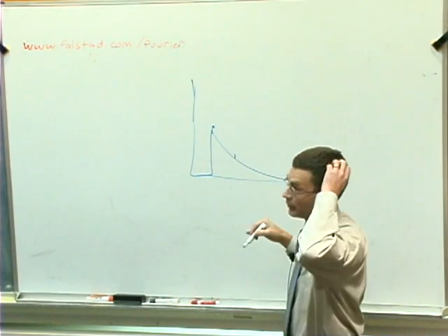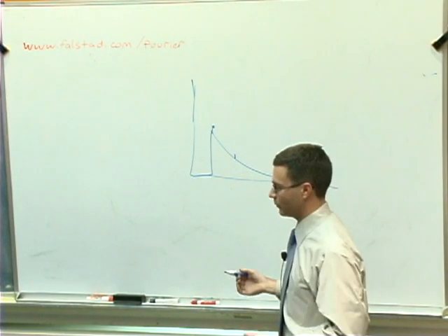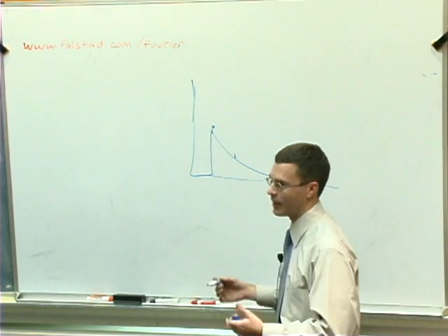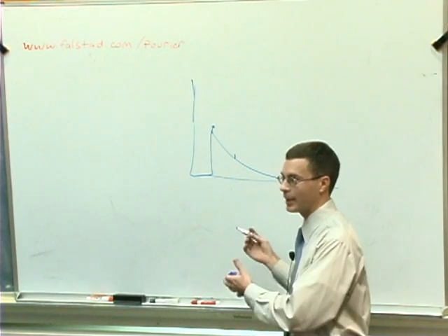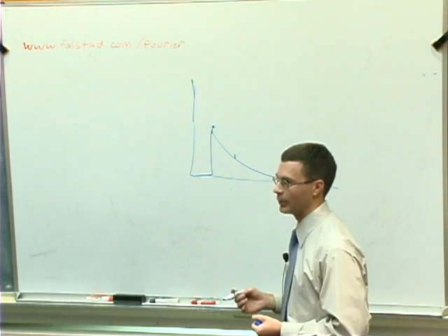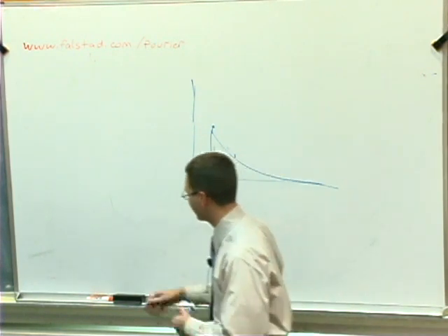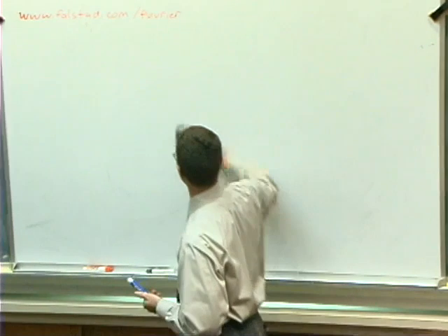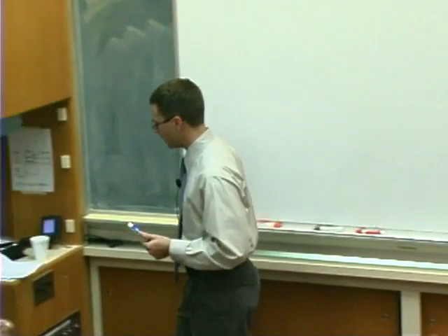So it's not simply filtering. It's what the mathematicians call a sandwich estimator for modifying this general linear model to take into account this pattern of the noise. So it's not, unfortunately, completely characterized or taken care of by just digital filtering. There are these additional things that have to be done.